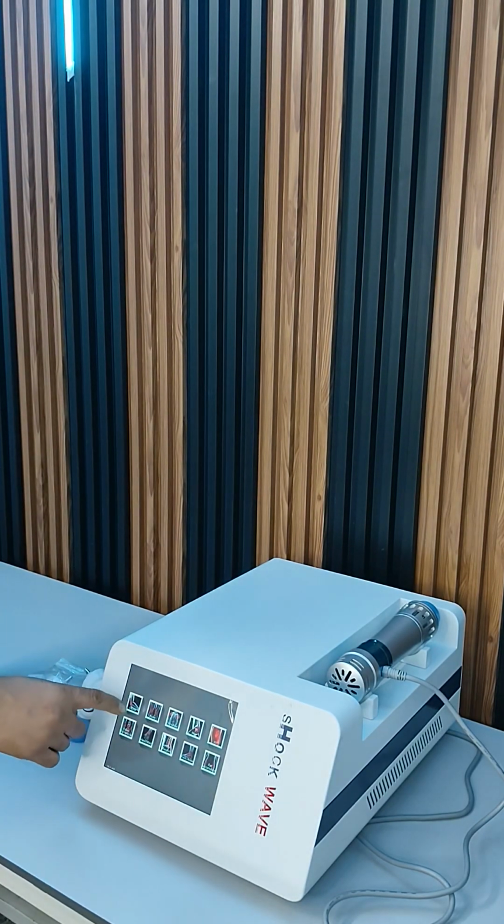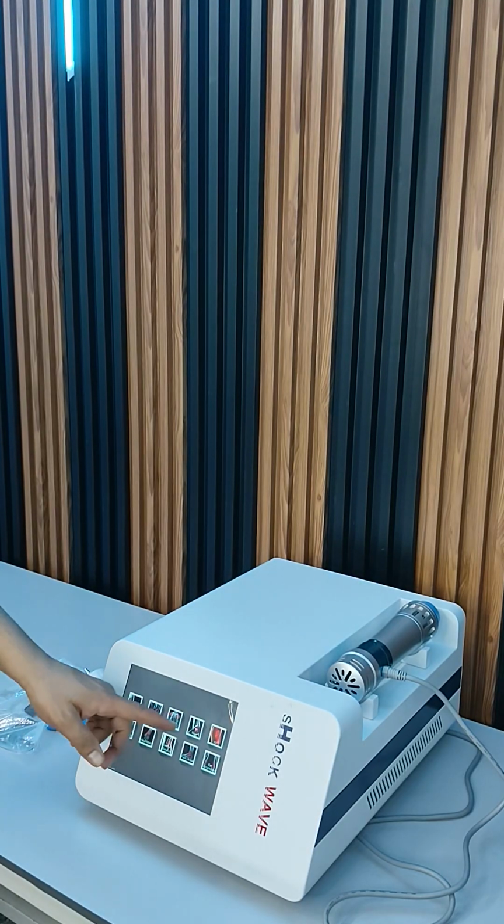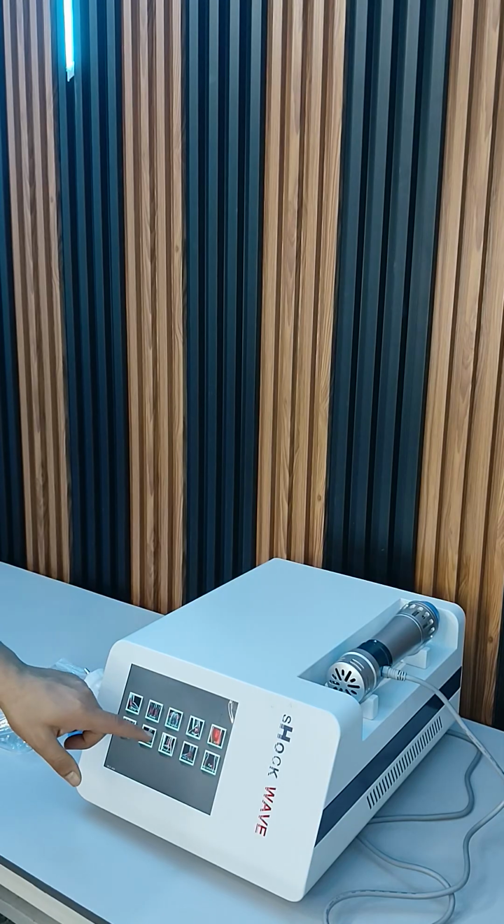So you can see elbow, knee, shoulder, hip, ED, pubic, hand, lumbar, foot, fat condition. So there are 10 treatment protocols, 10 treatment areas, out of which 8 are for physiotherapy purpose, 1 is for the ED, erectile dysfunction, and 1 for the fat condition.